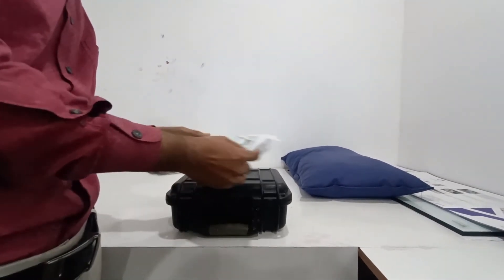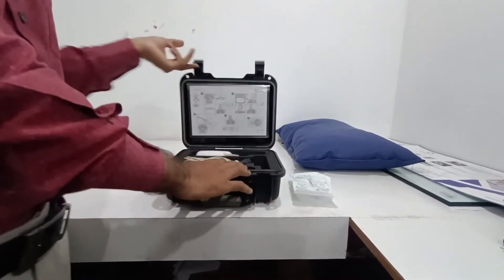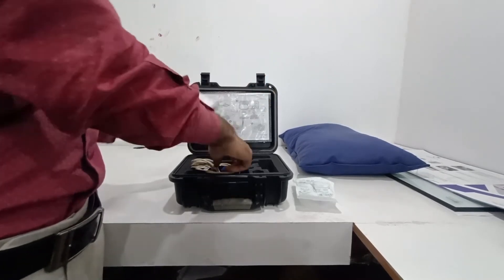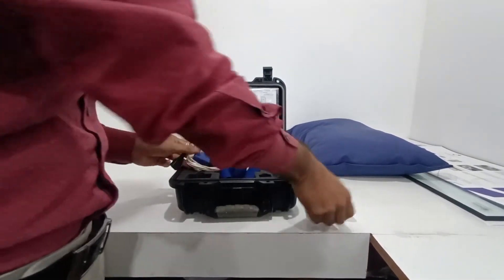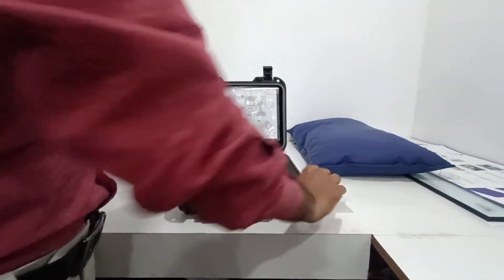Today we will see a level three sleep study from Philips — this is the Philips Night One. It has parameters including the oximeter, chest belt, and nasal cannula. Now we will connect it to the patient.